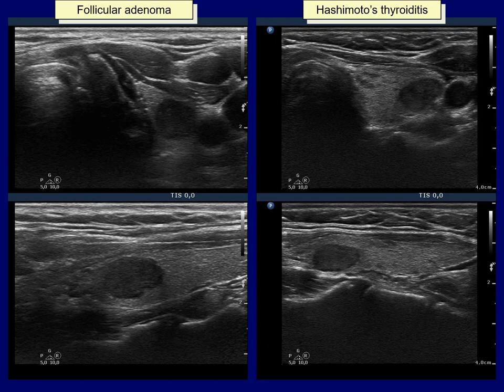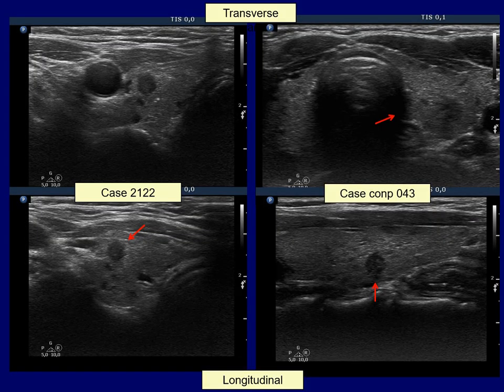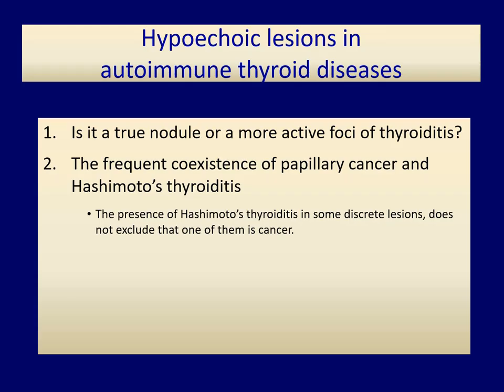We must accept that there are objective limitations. The presentations of these cases are very similar, almost identical — yet histopathology disclosed a follicular adenoma in the left discrete lesion, while the right lesion proved to be only a focus of Hashimoto's thyroiditis. Two other examples demonstrate the limitations of thyroid ultrasound: both patients presented with the focal form of Hashimoto's thyroiditis, but the largest lesion proved to be only a focus of thyroiditis in the left case, while it was a papillary cancer in the right. The relatively frequent coexistence of papillary cancer and Hashimoto's thyroiditis further increases the severity of the problem.